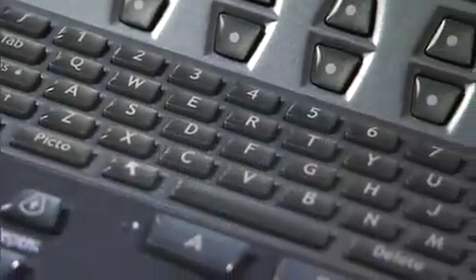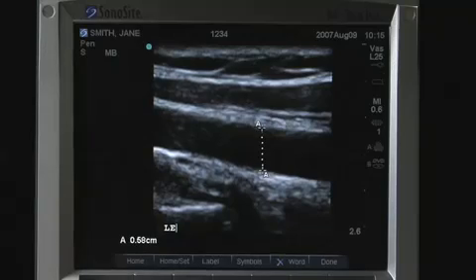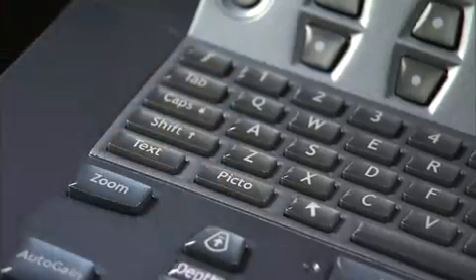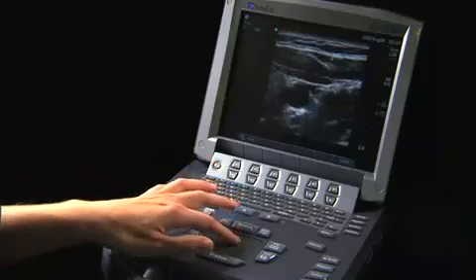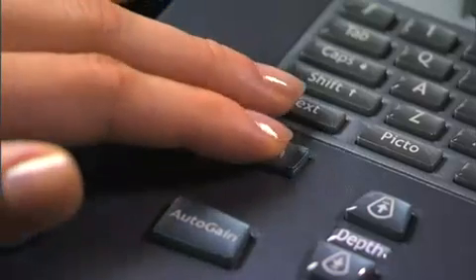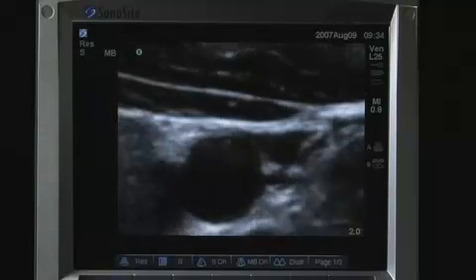The alphanumeric keys are used to enter text and numbers. The Text key turns the keyboard on and off for text entry. Picto turns the pictograph marker on and off. Arrow displays an arrow that can be moved and rotated within the image area. Zoom magnifies the image two times — press once to choose region of interest and again to magnify the area of interest.